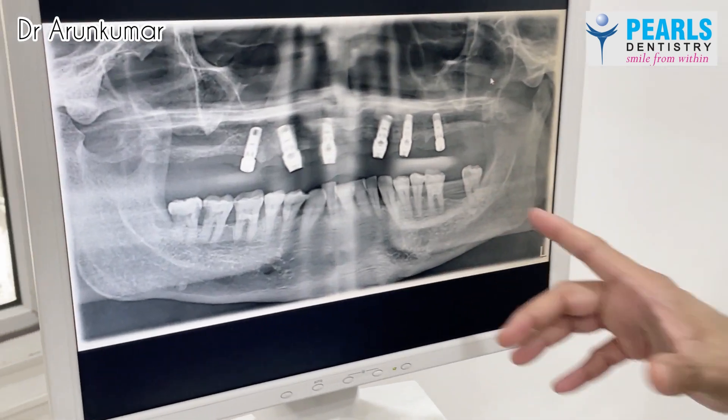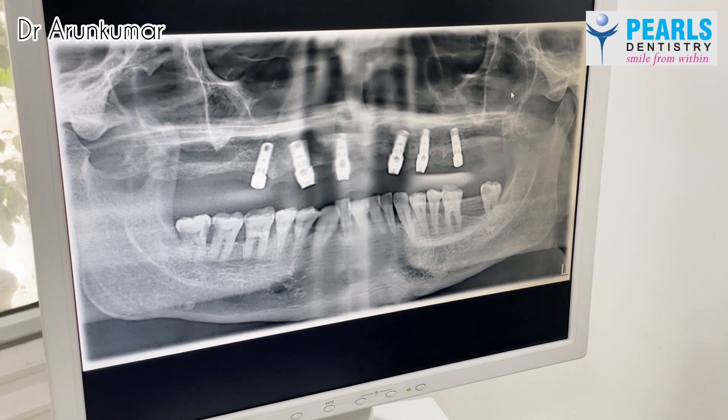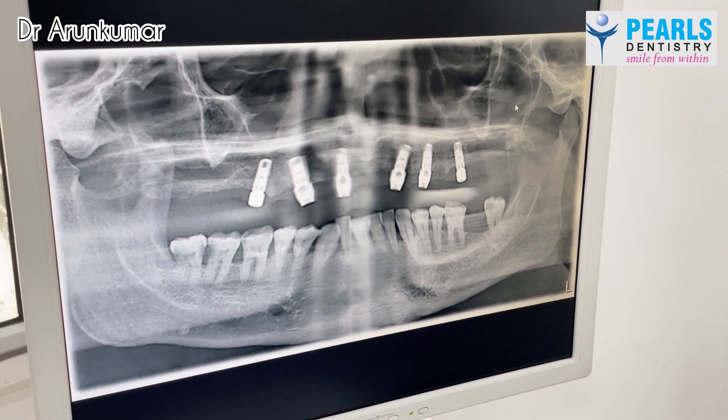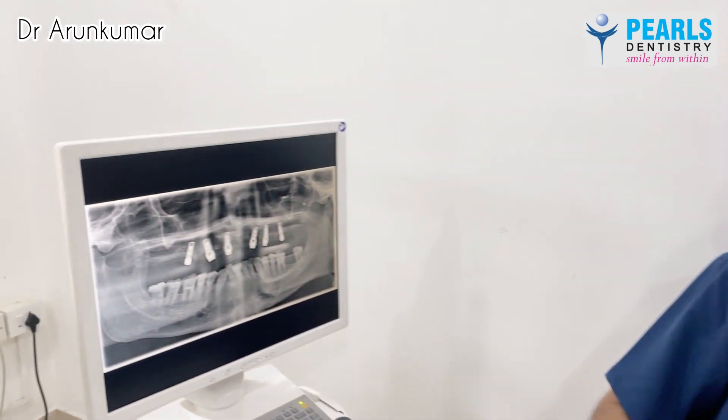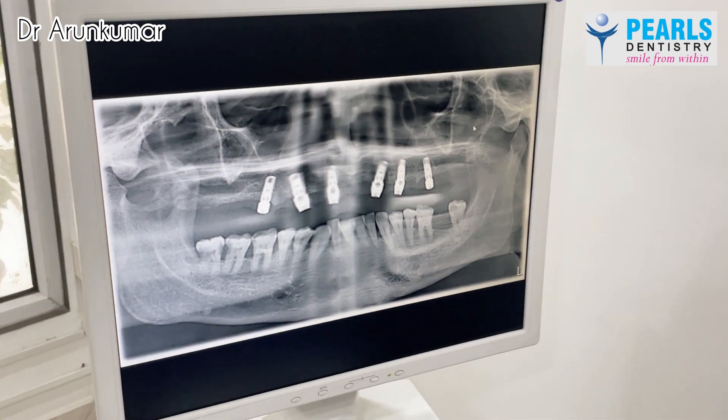We also discussed how the surgery can be done using sedation. Now, in this particular video, this is on the day of surgery — how we have placed the implant. We extracted the teeth and then used a surgical guide, because we are doing a guided surgery here. We did the CBCT planning and using the CBCT we perform guided surgery. We place the surgical guide in the patient's mouth, then level the remaining bone so that all the implants can be placed at the same level — as you can see in the X-rays, all implants are placed at the same level. Subsequently, we use the guide to place each implant completely guided. This makes the surgery very precise, reduces the time required, and improves the outcome.